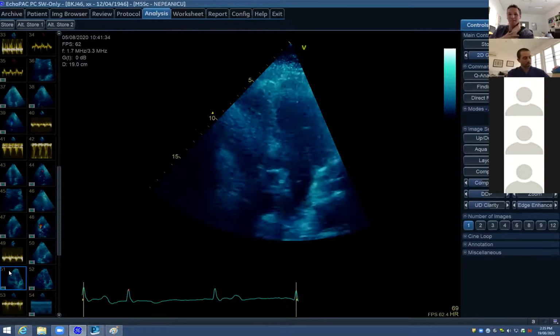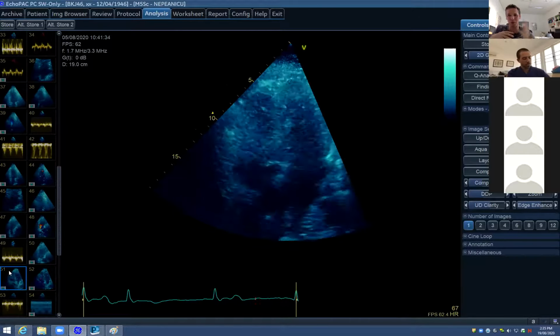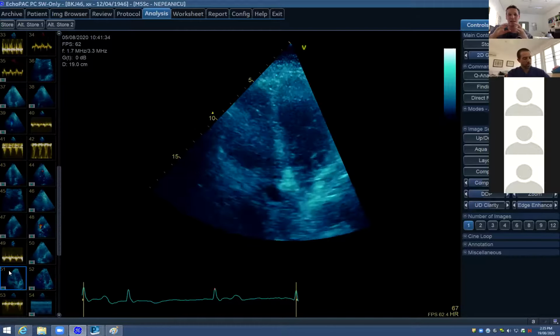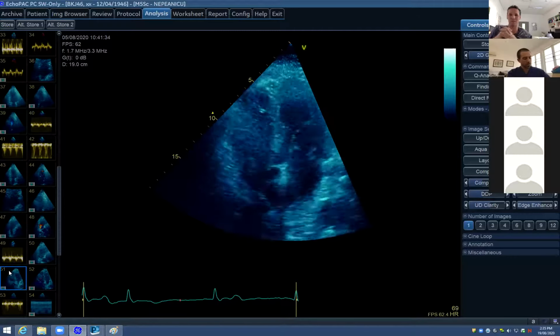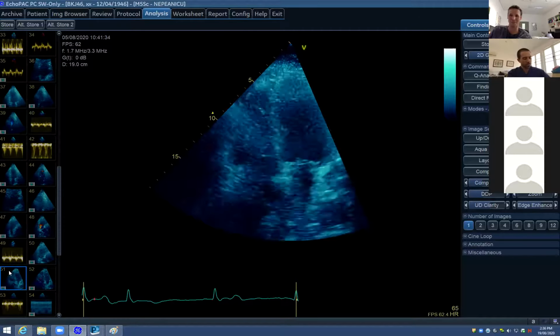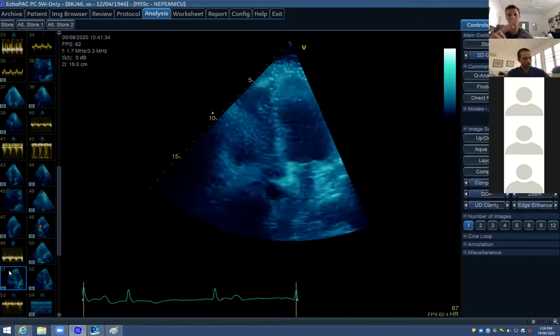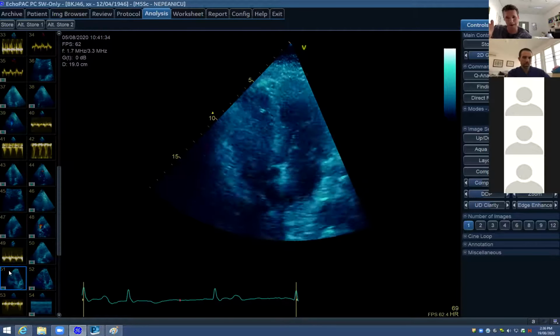And we were just explaining to the group about diastolic flattening being associated with volume overload of the RV, and systolic flattening of the interventricular septum during pressure overload. So I'm sure you knew that. I was just explaining it to the group. So if you're back now, if we're assessing it in the parasternal long and short, we've got to back it up in other views.